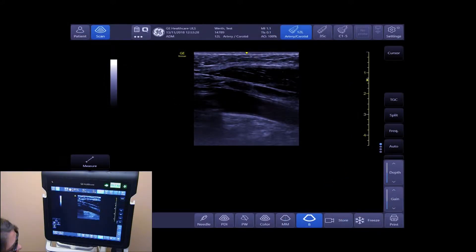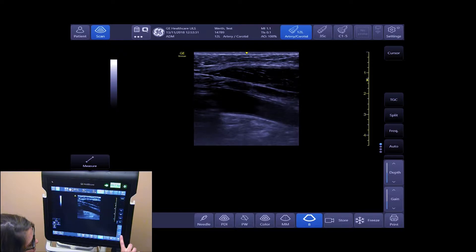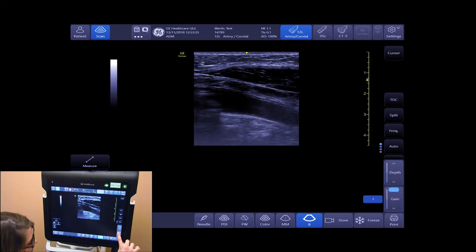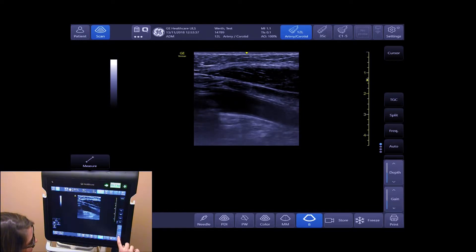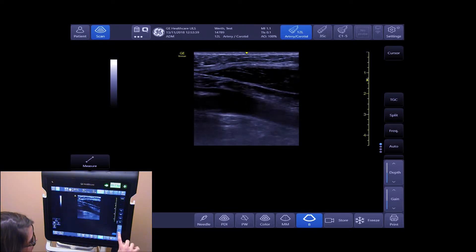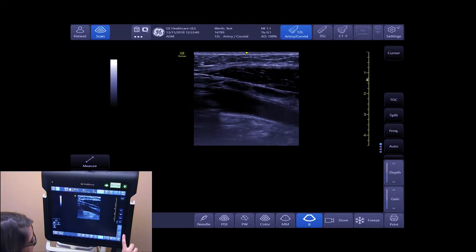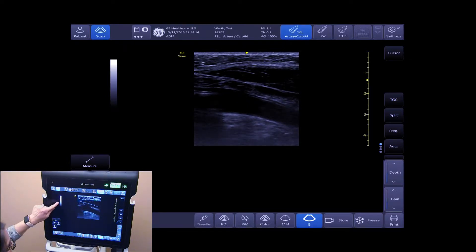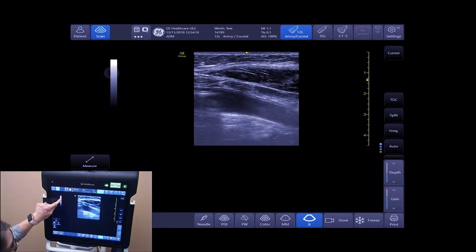To adjust gain, on the right-hand side of your touch screen, increase and decrease your gain by selecting the arrows. You can also adjust your gain by sliding your finger up and down your grayscale bar.